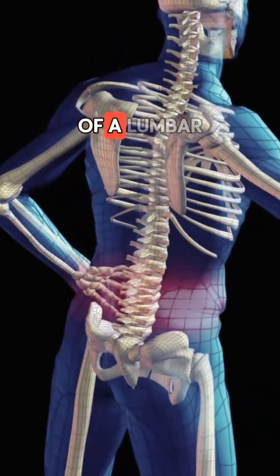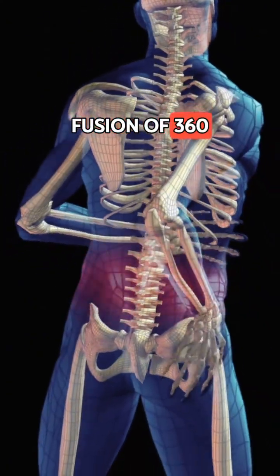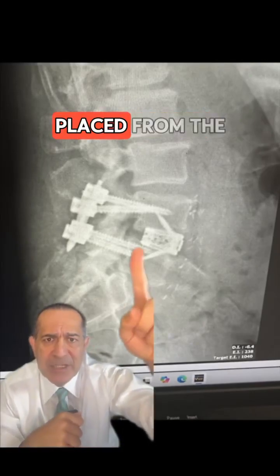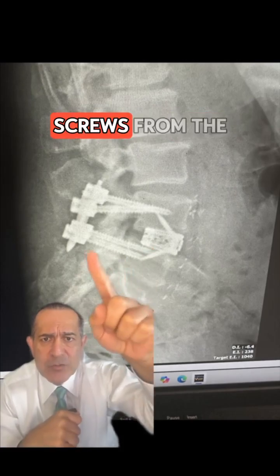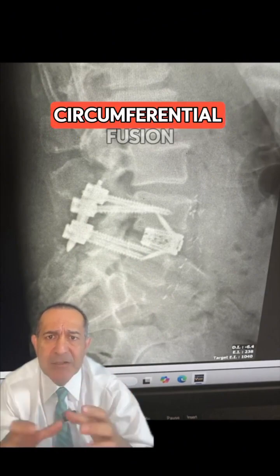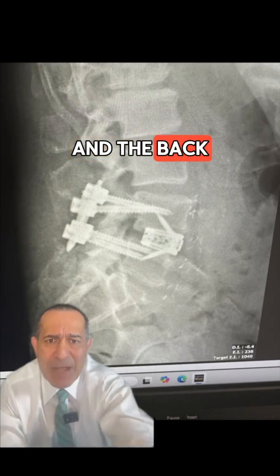What does it mean when we speak of a lumbar fusion of 360 degrees? In this x-ray, we can see that there is an implant placed from the front and also screws from the back. So 360 degrees means it's a circumferential fusion from the front and the back.